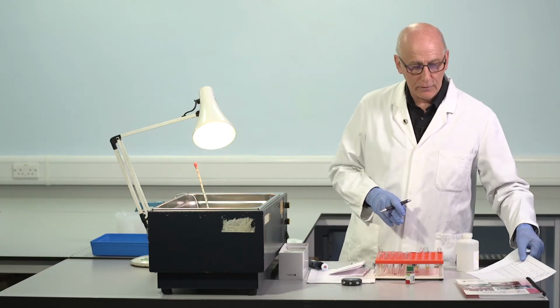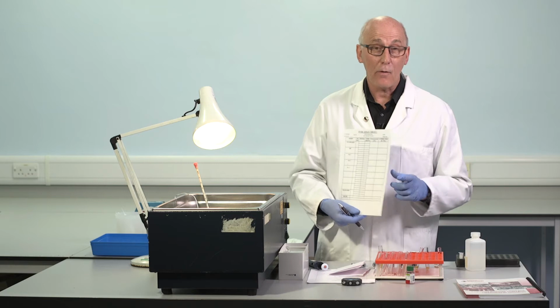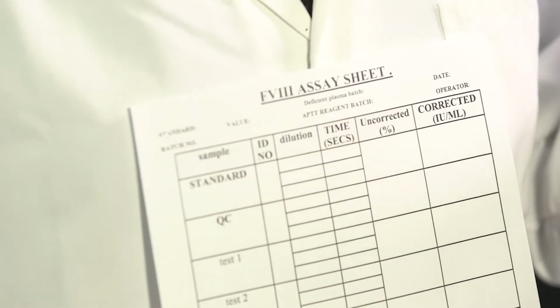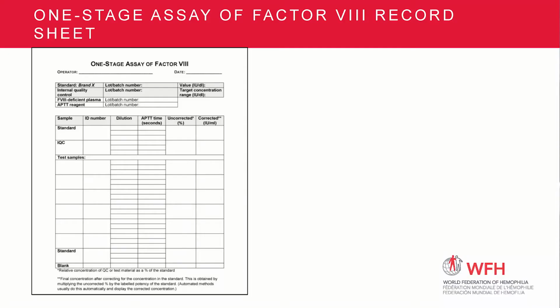It's useful to keep a record of a number of aspects of the assay that's being performed. And one way to do this is with a results sheet in this kind of format. And there are a number of pieces of information that I think it's important to record. We want to know the standard that's used, the deficient plasma. In particular, we want to record which lot numbers. Because if we see a change in some results or there's a question about any result, it's very useful to be able to trace back the results and see what happened. Was there a change when we moved from one lot number to another?